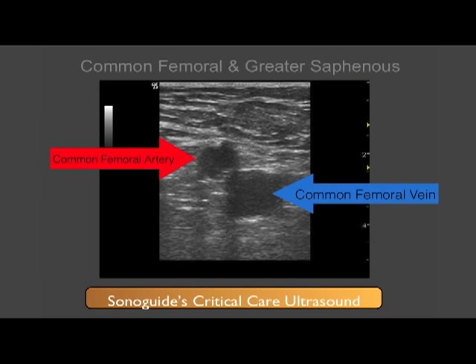However, on this image obtained from a different patient, you will note a more textbook anatomy of the common femoral artery and vein. If you recall from anatomy class, the mnemonic NAVAL — the common femoral artery is more lateral to the common femoral vein, as you would classically see.